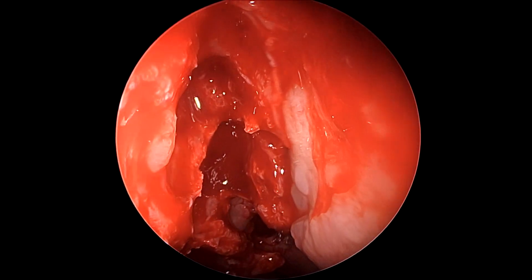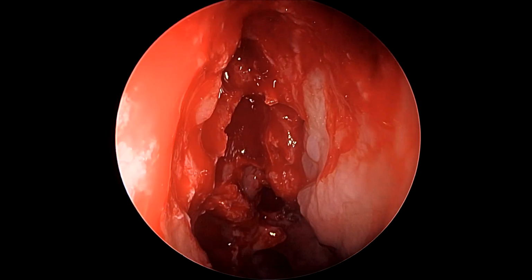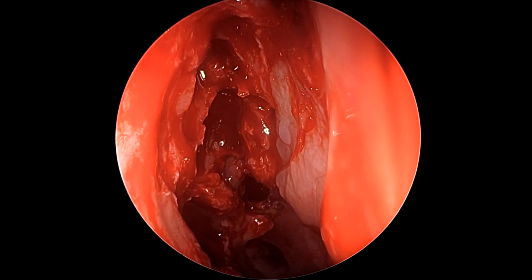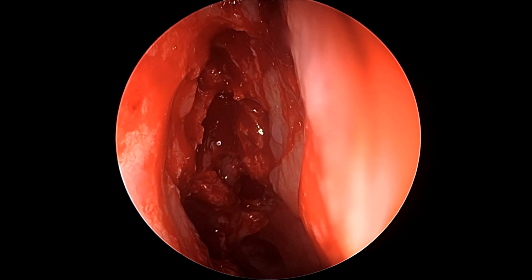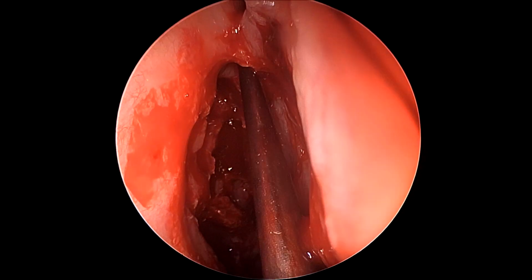So some removal of the anterior wall of the agger nasi is very important because it lets us inspect the frontal recess with a 0-degree endoscope quite comfortably. Otherwise, we would have to resort to the angled endoscopes very soon. So that is also fine, but it also creates another opportunity for us to examine.